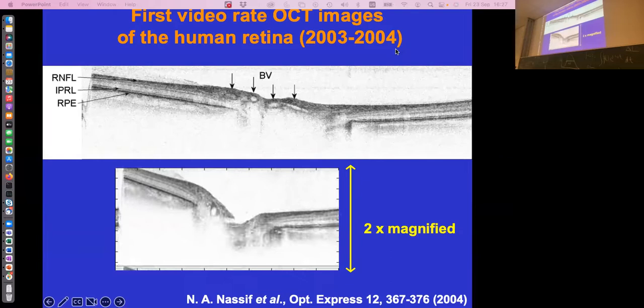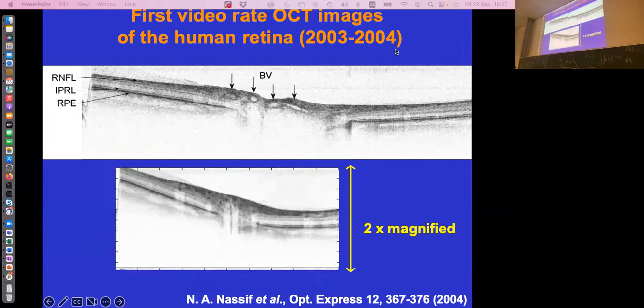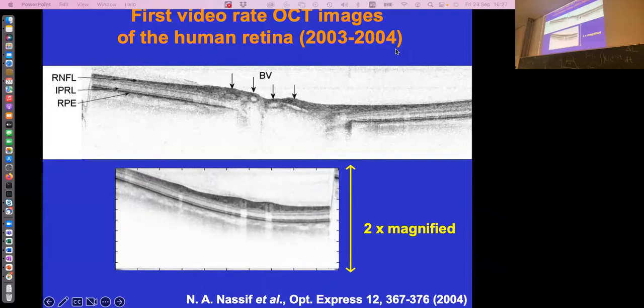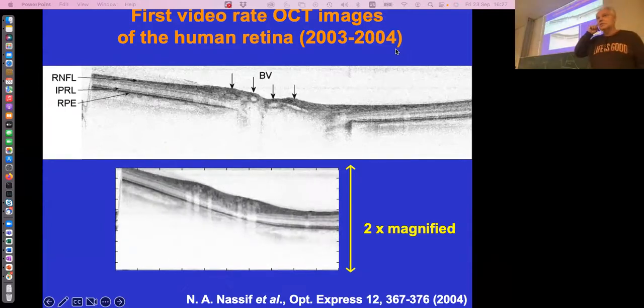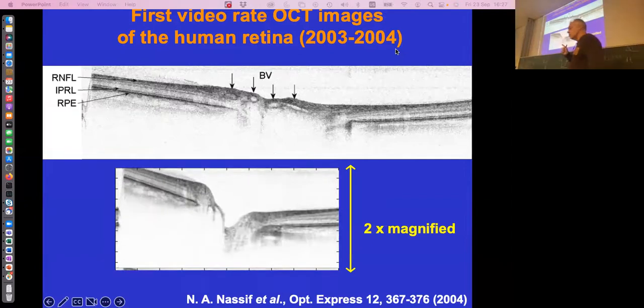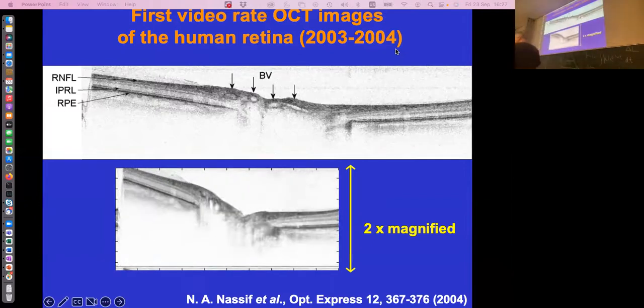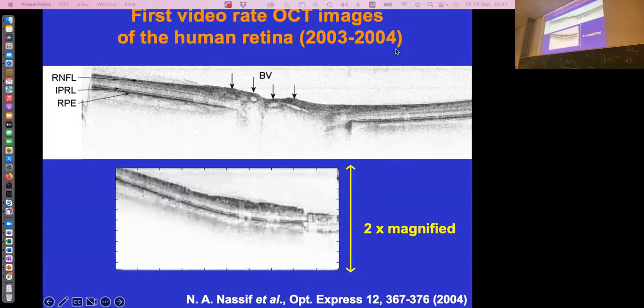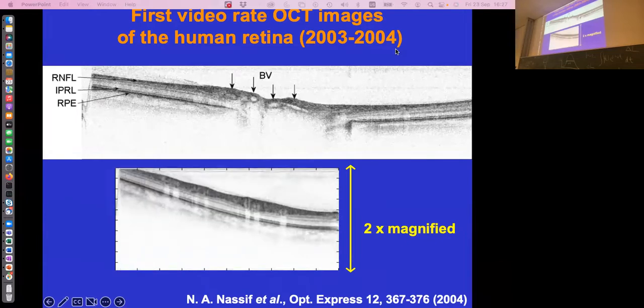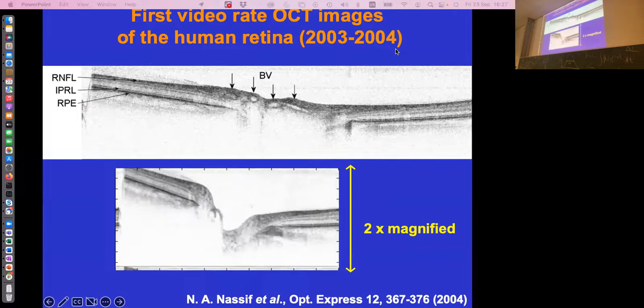So this is real-time data acquisition? Yeah. It has completely changed this field. You had one manufacturer of OCT systems, Zeiss in California. They were selling basically the system that produced a frame every 6 seconds.